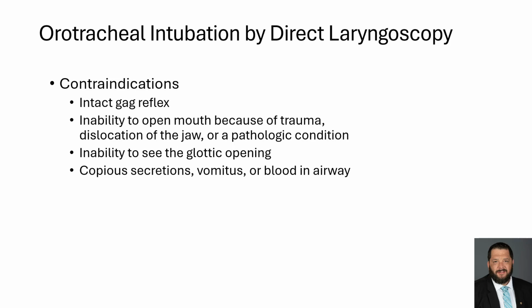Obviously, you have to be able to see the airway to manage the airway, but you will need to use other tools at your disposal to help facilitate this process. Things like suctioning, things like use of McGill forceps. Okay, you're going to have to be able to manage this patient's airway if their presentation dictates it. So while there are significant implications, you need to ensure that you're comfortable and competent with this skill set, as this will be a fundamental part of your patient care and patient management.